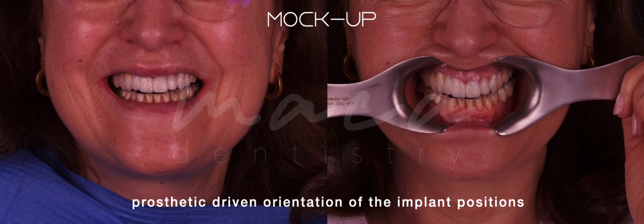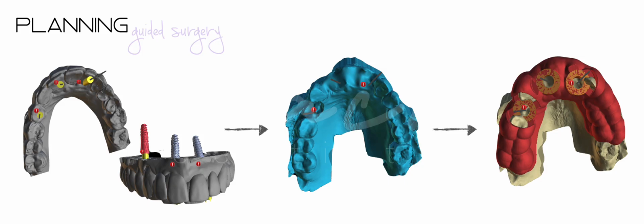As already stated, the planning of implants based on the desired final position of the teeth is a key factor of success in implant dentistry. So, after we approve the mock-up, this is the same story as we told before. We have to do the prosthetically driven implant surgery, and to do that, we do the guided surgery and plan the implant's position in guided surgery.